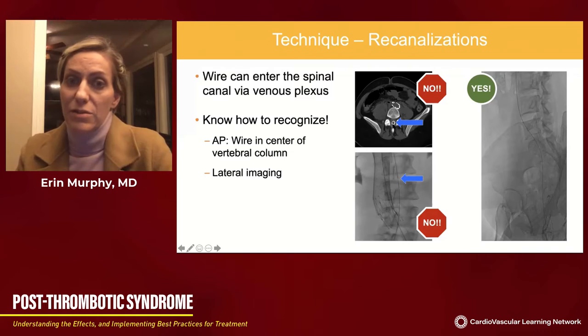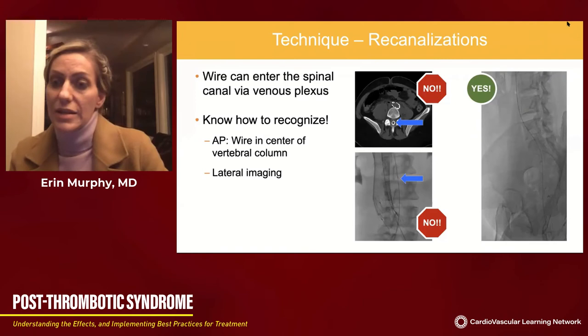So what you should have on your imaging is a nice gentle curve laterally that goes anterior to the vertebral bodies. And you always want to check a lateral to make sure on your recanalization cases.